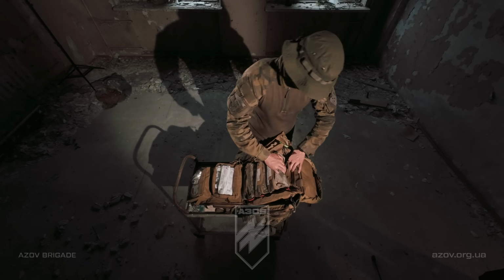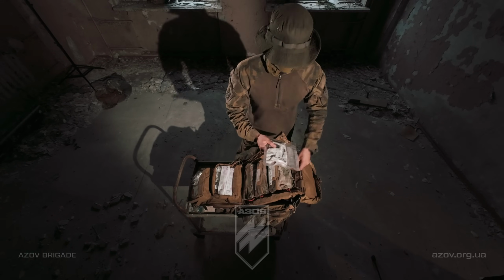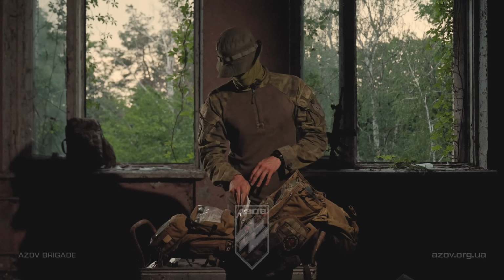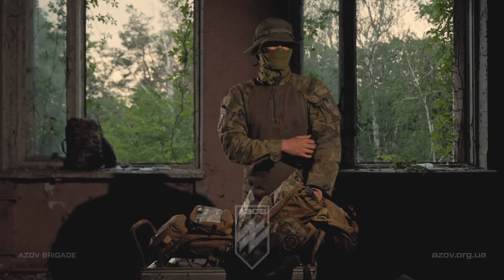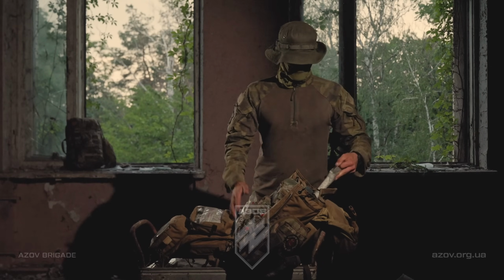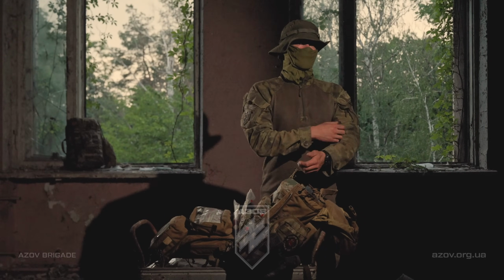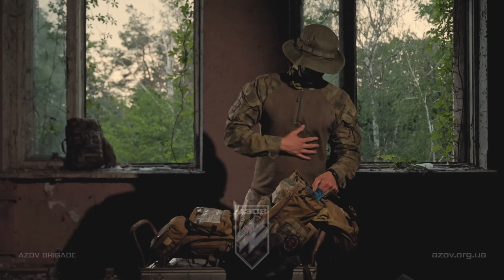They will give you one of these. Again, okay, so first things first, at the top of that pouch I have Exstat, which I'll push into the body, push the needle down. It basically injects small sponges which expand with the blood and clot the wound for you. They have a hemostatic agent on them as well. So I have a large one and a small one. These you can use for through-and-through wounds where you don't really want to pack it. You could just use this. Don't use that on the body though, on the box.